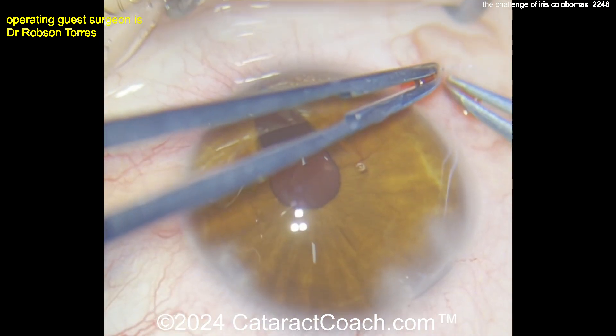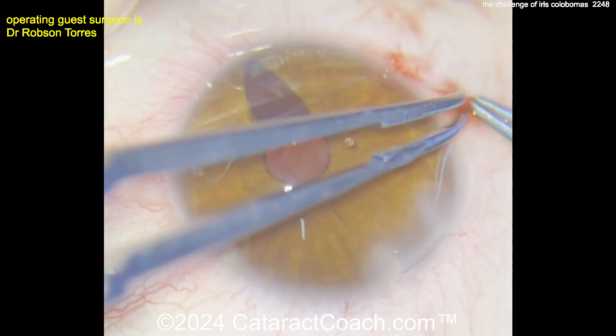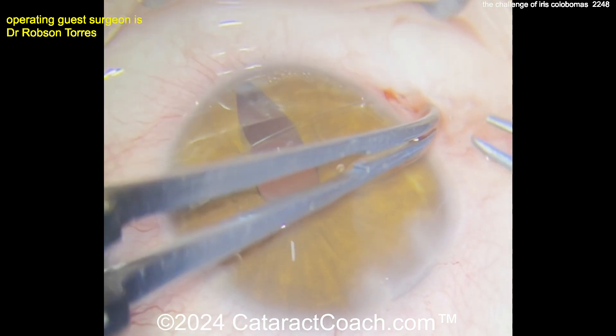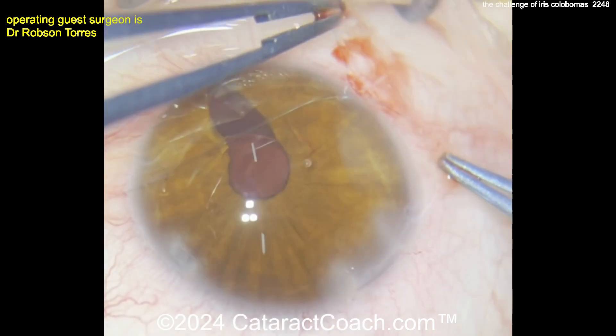This is a 10-0 polypropylene suture, most likely. We'll get the ends out and do that four-throw pupilloplasty — one, two, three, four throws. It's a little bit hard to see on video with 10-0 polypropylene, but once you do that, it'll bring the pupil down.